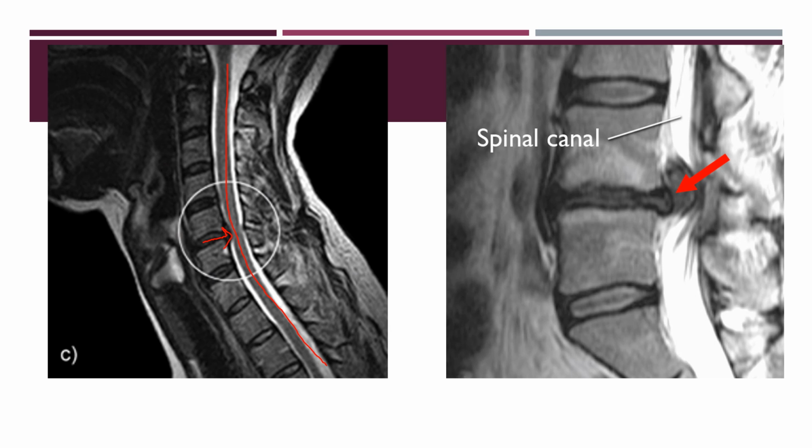And then here on the right-hand side, you can see this is a really large disc protrusion. We have our nice spinal canal here again. You can kind of tell where we're at in the lumbar spine here, L4, L5. Look at this big disc herniation pushing into that spinal cord. Do you think that's going to cause problems for your patient? Definitely. So we can use mechanical traction to help reduce this disc material back into the center by creating less pressure on the disc and kind of getting that suction to pull that nucleus pulposus back in.